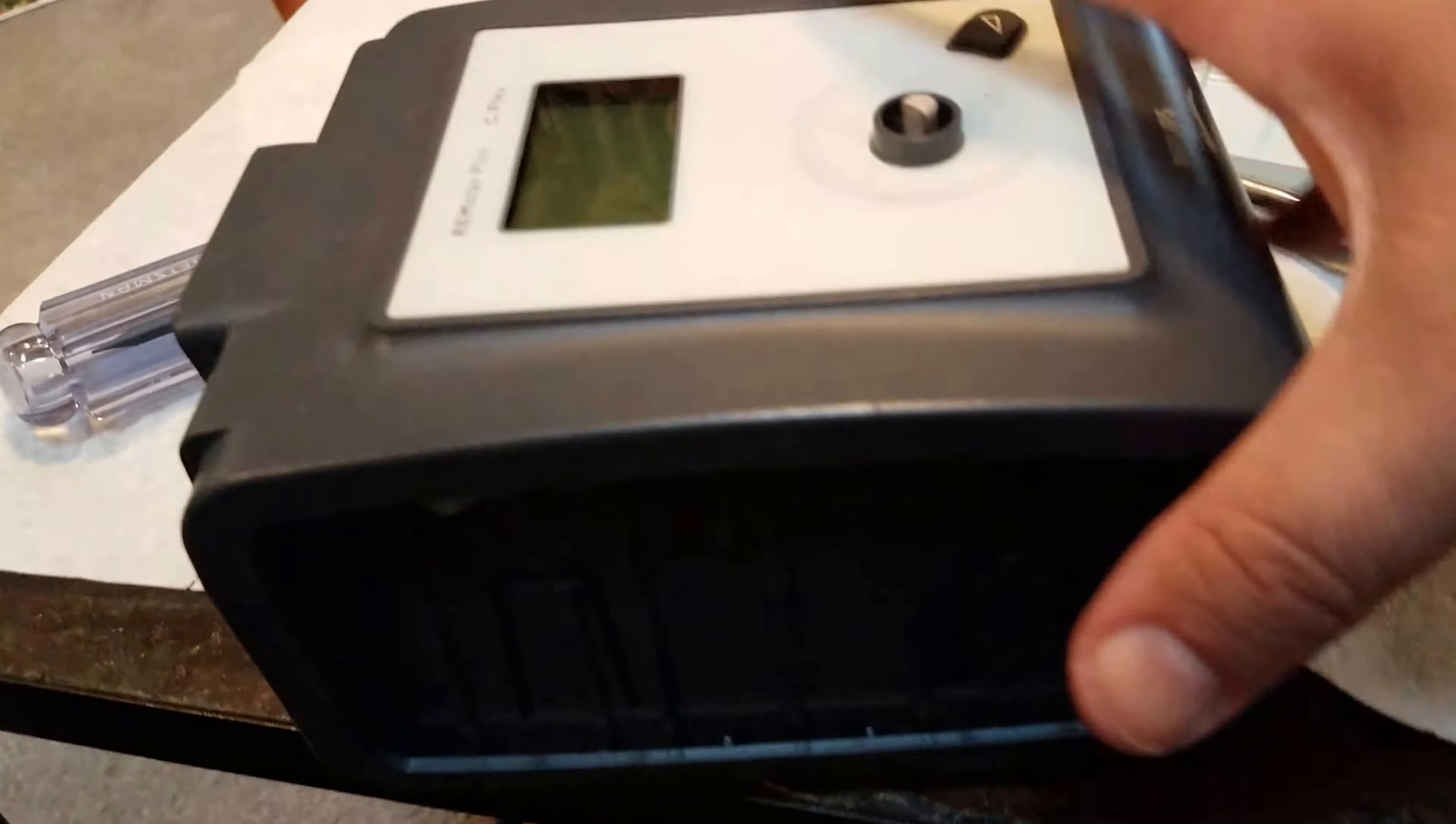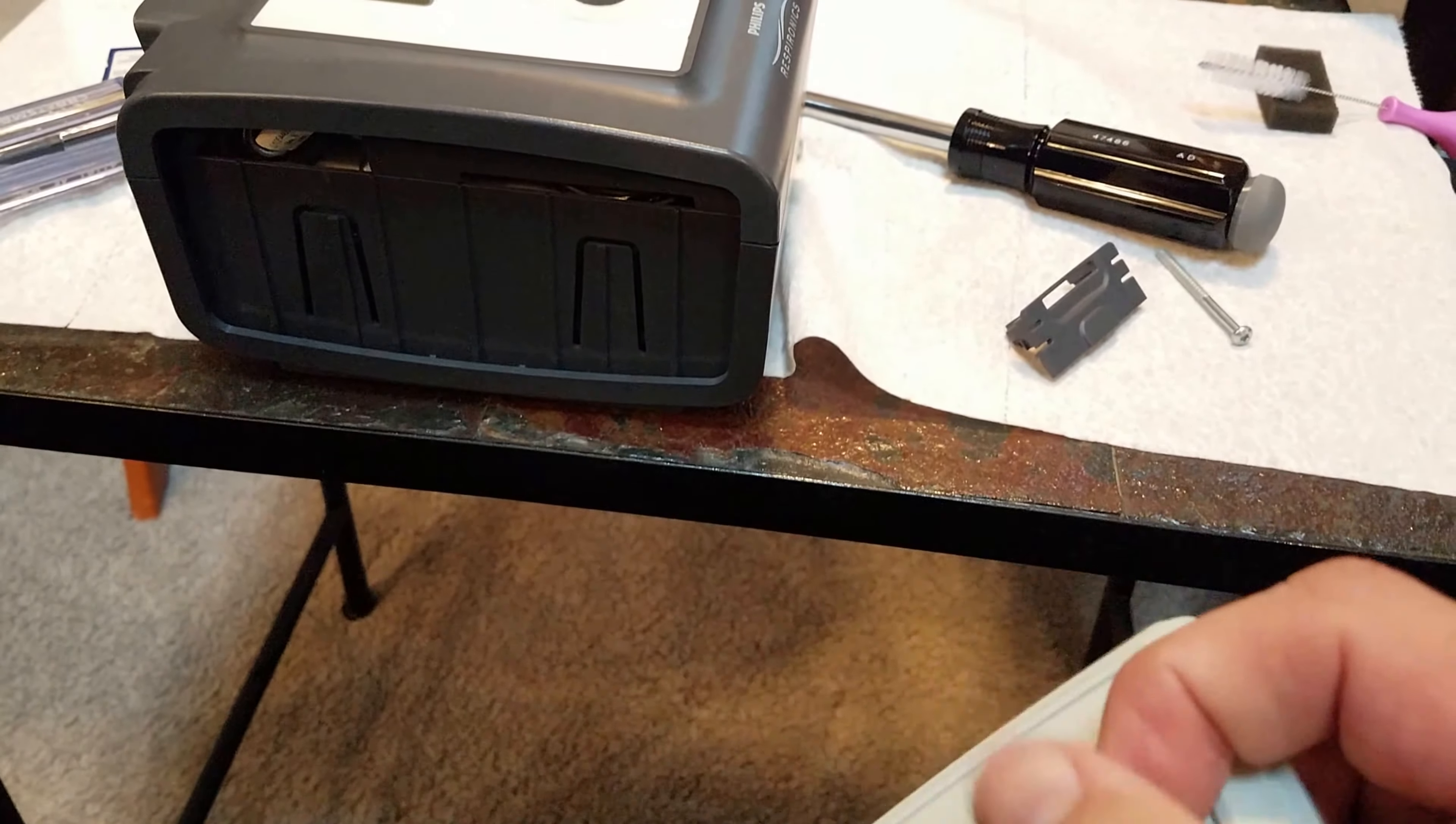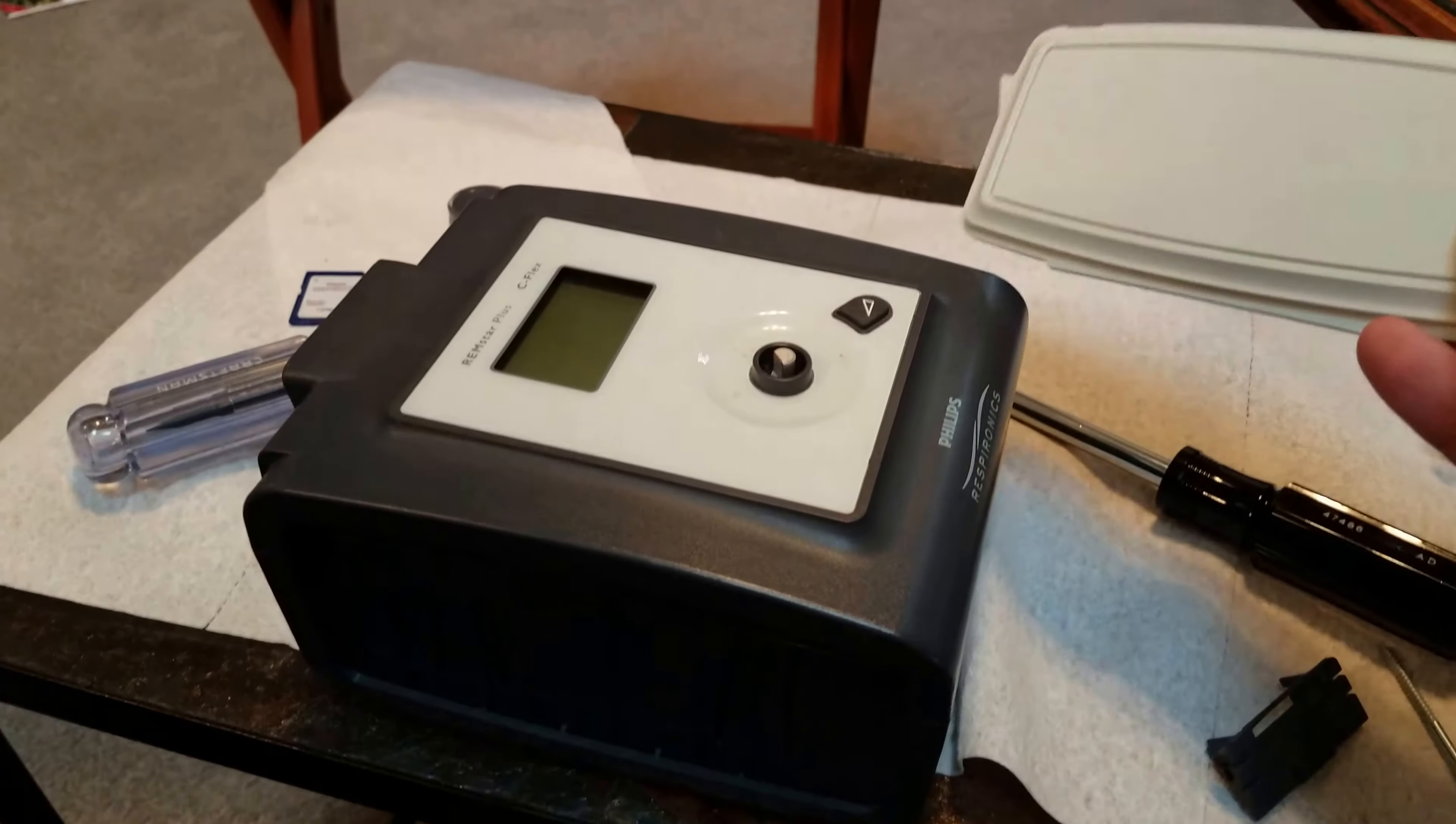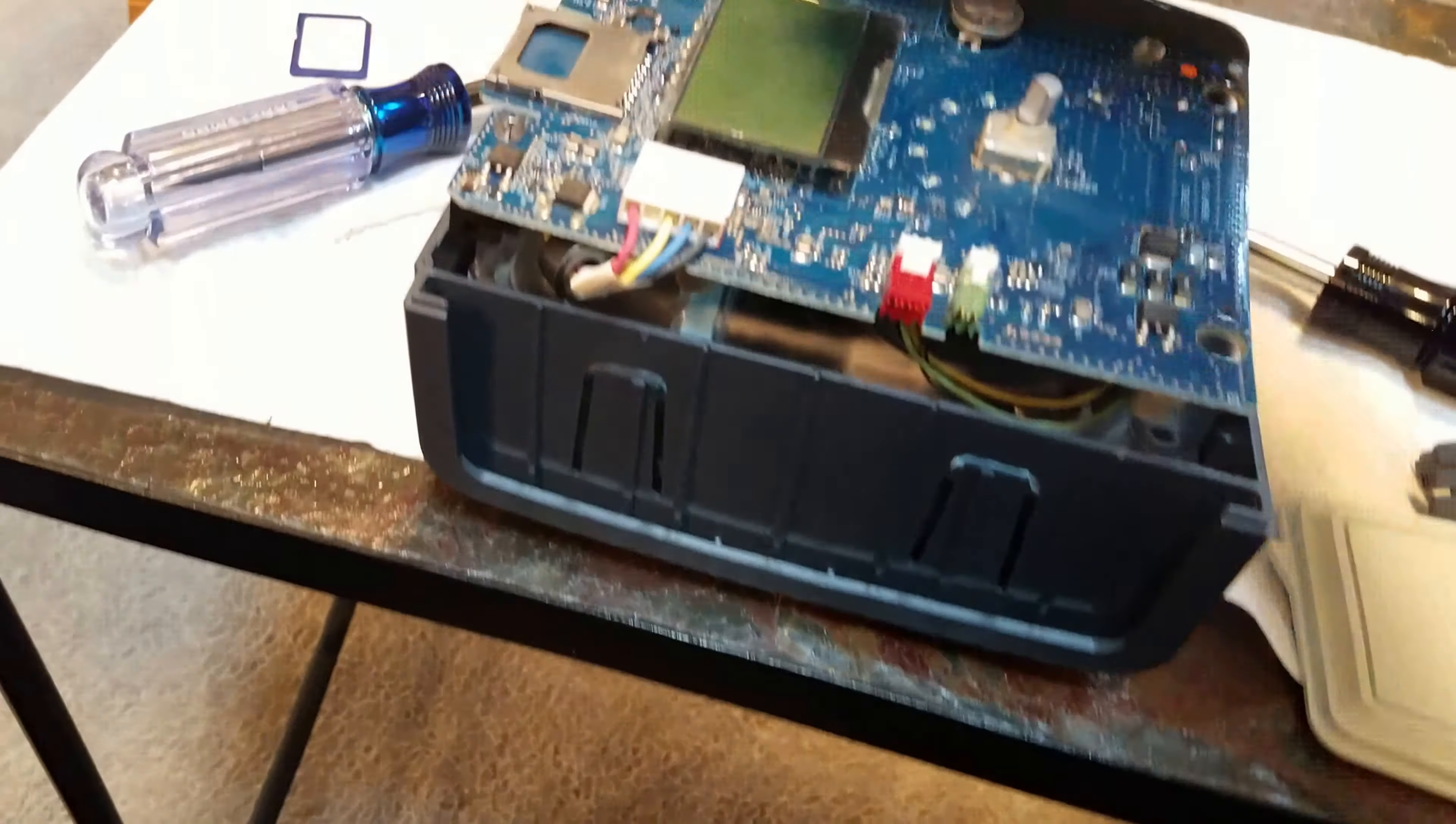Here's something else I forgot: this little cover. Your machine probably came with two of these, one for this side, one for the other side, if you do not use the humidifier. I occasionally do. I don't usually use it, but occasionally I do.